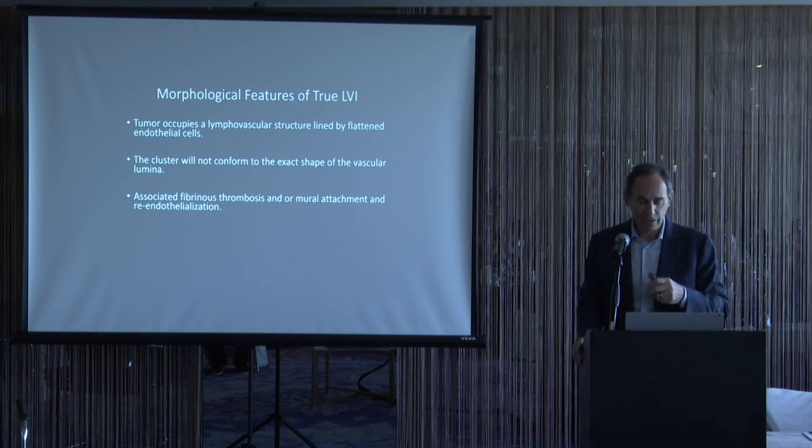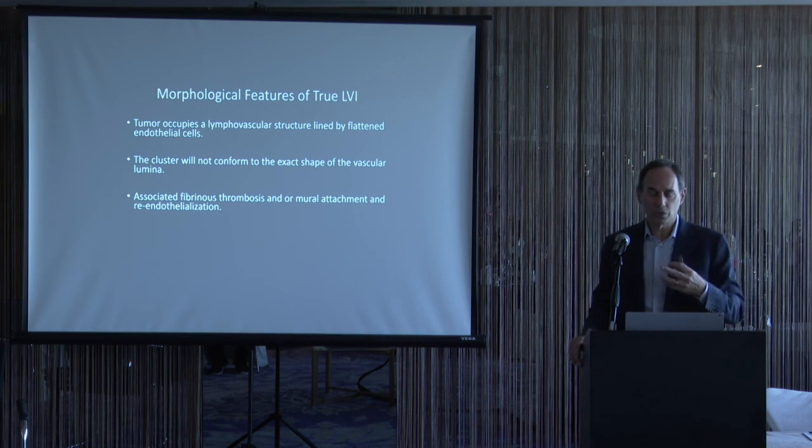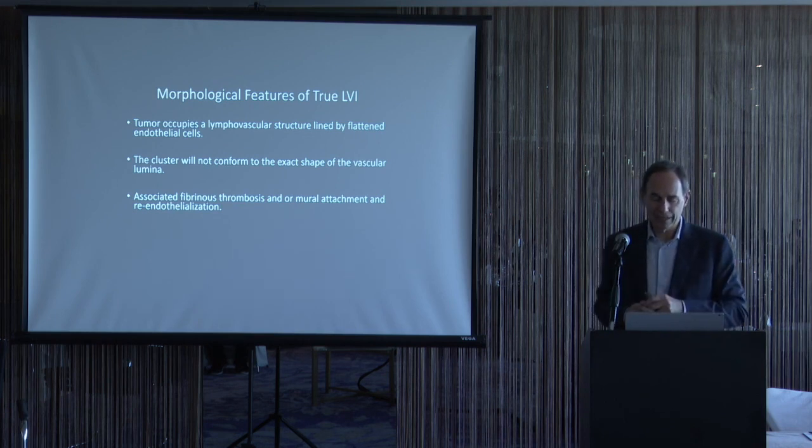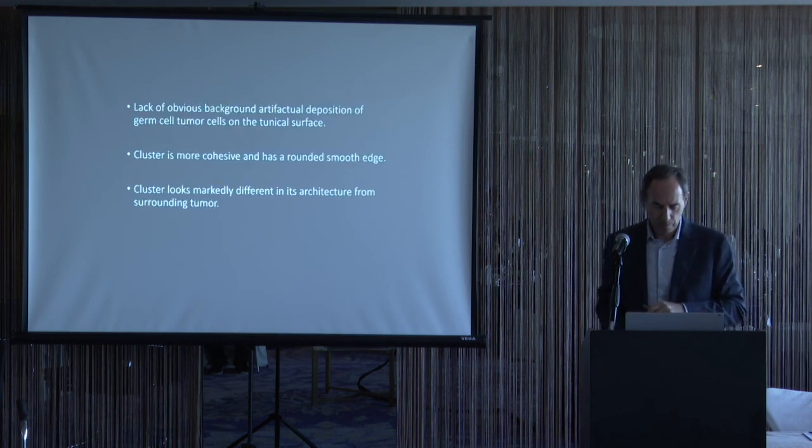What I also look for is fibrin thrombi associated with the tumor cells. That means it's more real. It's elicited a reaction. Also, you look for mural attachment. That tells you, again, it's real, not artifact. And sometimes you'll see re-endothelialization over the tumor thrombus. Again, that's real, not artifactual.